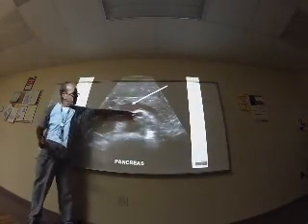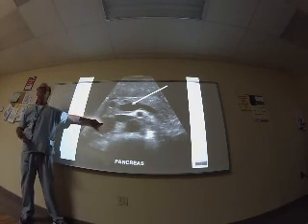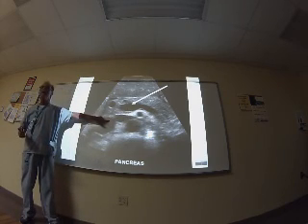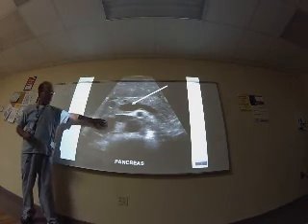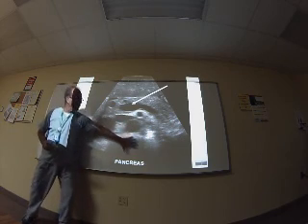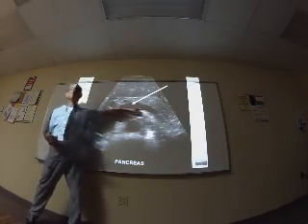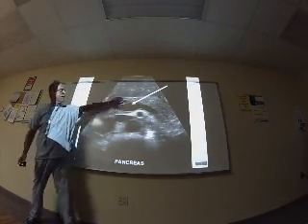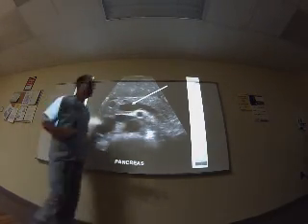Pancreas, superior mesenteric artery, aorta, IVC. You know what this is? The left renal vein, the only vein that curves anterior to the aorta. IVC, left renal vein, aorta, and what is this? The vertebral column, and this is the confluence. And the confluence is the beginning of the portal vein. Head of the pancreas, neck, body, and the tail. And what is this? I don't know.